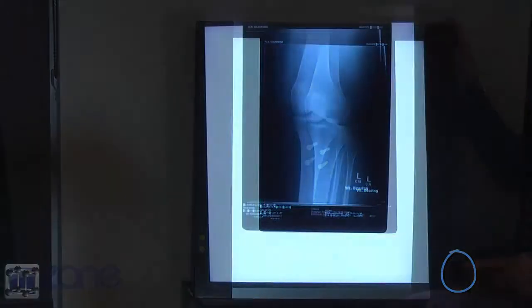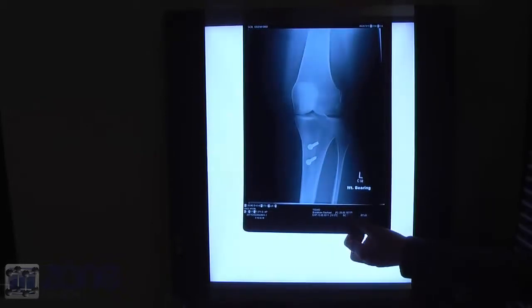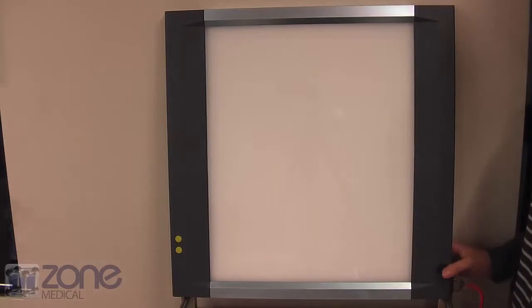For an automatic power switch, click so that the two lines are down and it automatically turns on and off as the film is added or taken away. The auto film activation function allows this to happen, and the side clips will automatically hold the film in place.